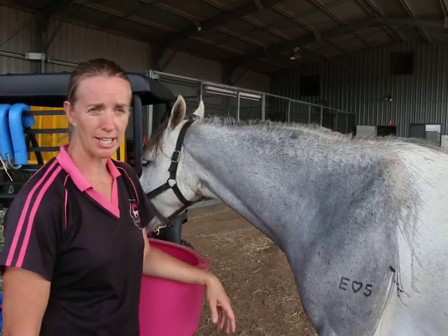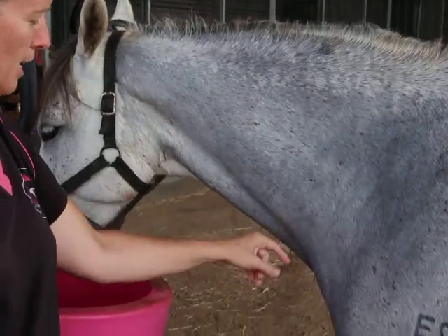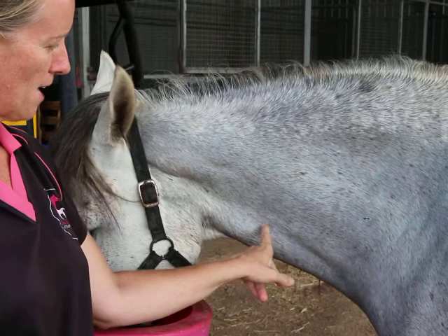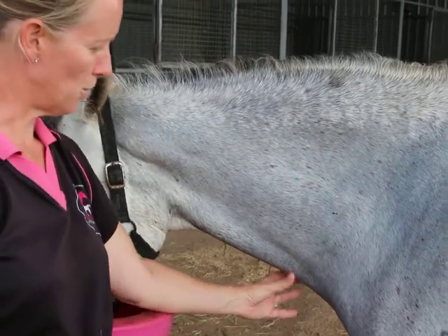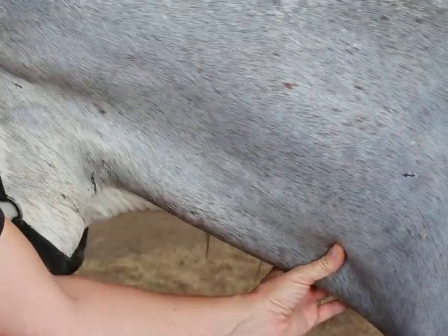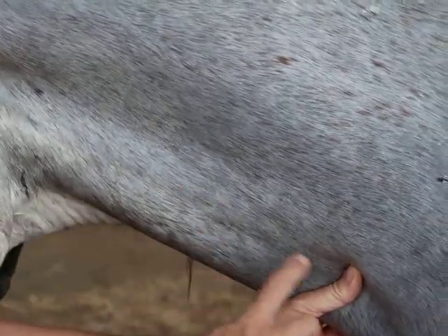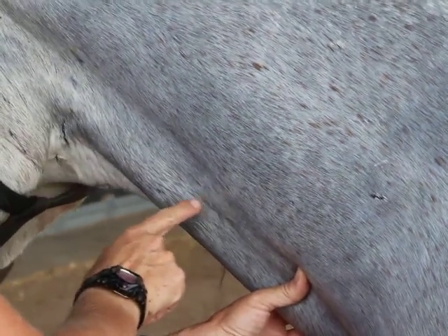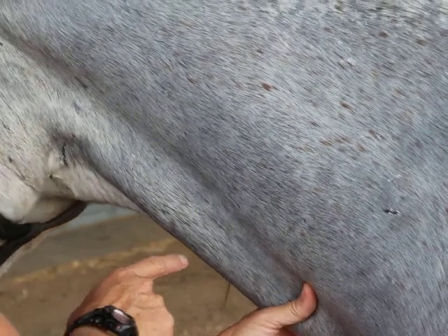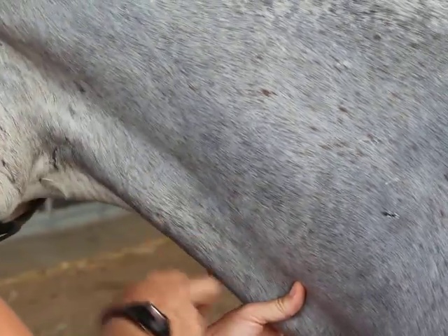We choose the jugular vein in the horse, and it runs in what we call the jugular groove here. It's about the size of my little finger and it's not far underneath the skin. When you have a needle and need to inject, you have to occlude the blood vessel — block it off to stop the blood running away so that it fills up. You can see the jugular filling up there; when I let go it drops down, and when I occlude it, it fills up and then disappears when released. That's the jugular vein.